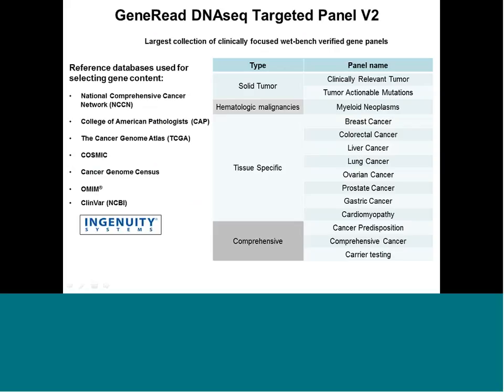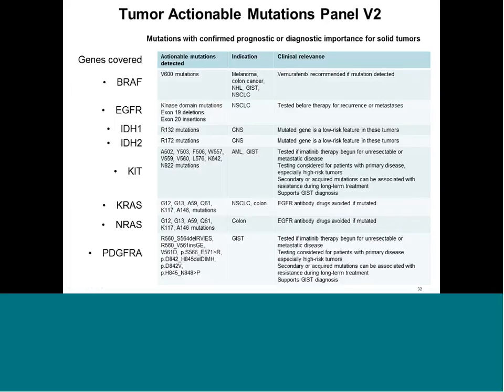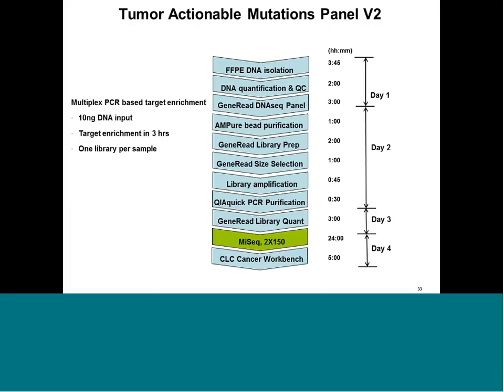What are the genes that are interesting for my clinical questions? And then you can either design your own PCR pipeline, or you can use a number of already commercially available mutation panels, like for example this Actionable mutation panel from QIAGEN, and analyze these genes in your tumors.